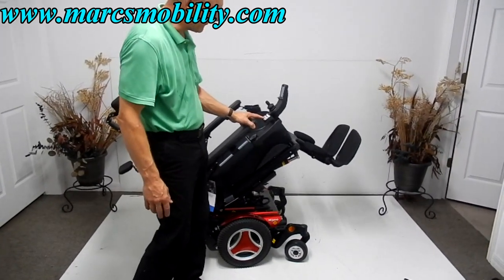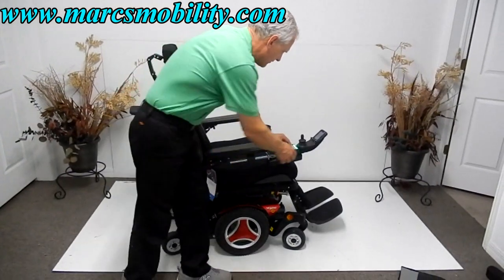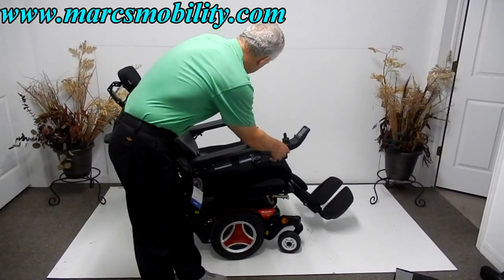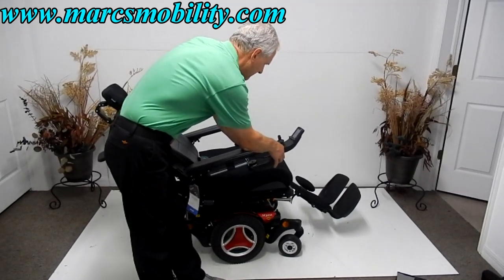This is considered a full electric tilt. For the electric recline, we'll do the leg and the recline at the same time to save time — I'm hitting both buttons simultaneously so the back and the legs go up at the same time, but you can do them individually or together through the joystick.